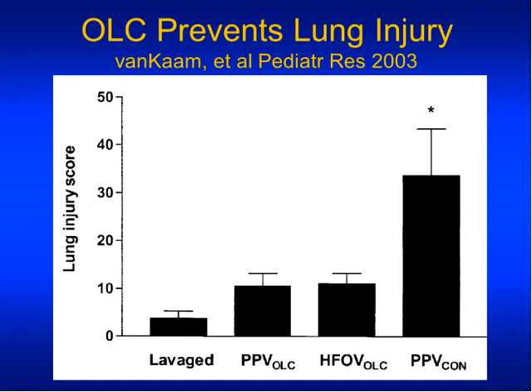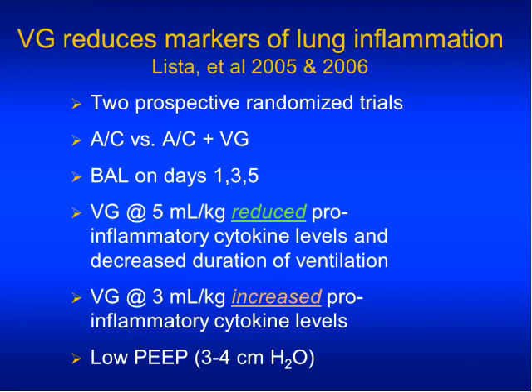So this suggests, and many other studies of a similar nature suggest, that it isn't really the high frequency itself, but rather the fact that we are routinely using the open lung strategy with it. And perhaps arguably in some babies, some of the sicker babies, it is easier to achieve lung volume recruitment with high frequency. But if we can achieve it with conventional ventilation, we probably have the same benefits. So it's the open lung strategy that's key.